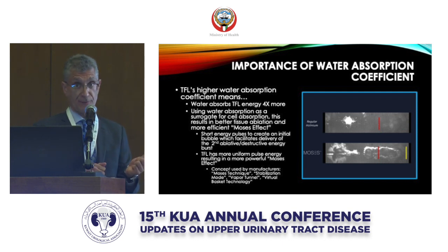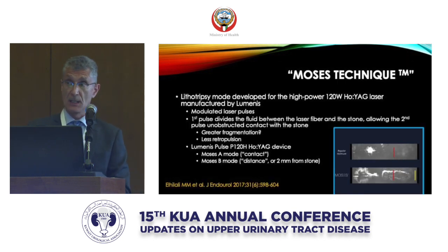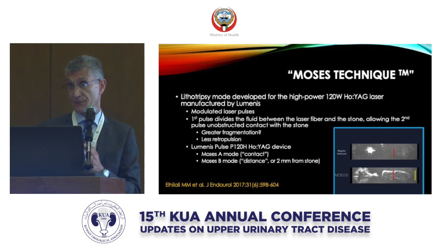The retropulsion effect that was shown in the early studies also seems to pan out, at least in these preclinical studies, where it looks like with various settings with the thulium fiber laser, generally you can avoid or minimize the retropulsion effect. There are some concerns about this higher energy that the thulium fiber laser can provide. Does it cause some deleterious effects, such as heating the fluid, perhaps to a dangerous level that in a clinical situation could lead to some tissue fibrosis? And certainly there does appear to be a higher degree of temperature creation using the thulium fiber laser.